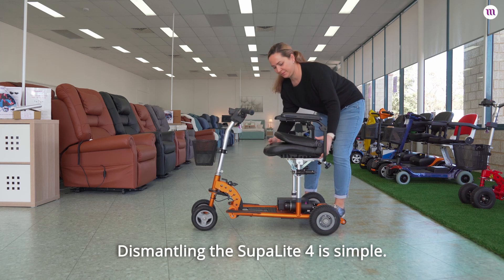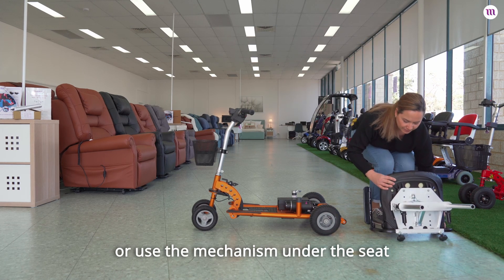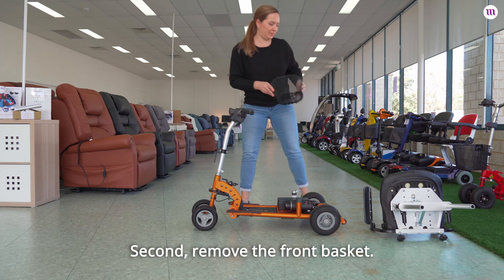Dismantling the SupaLite 4 is simple. First, remove the seat by lifting it straight up, or use the mechanism under the seat to fold it flat before lifting it off the scooter. Second, remove the front basket.